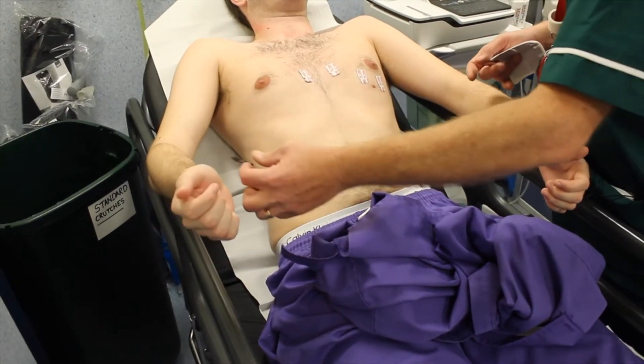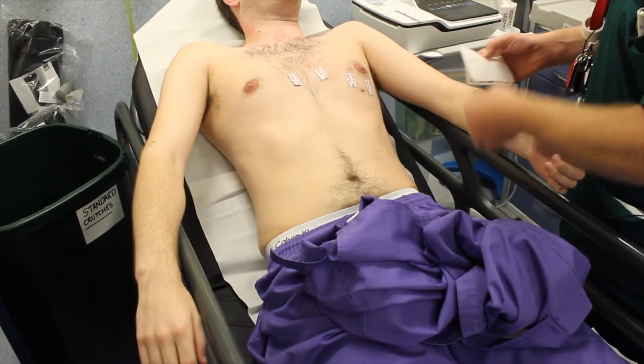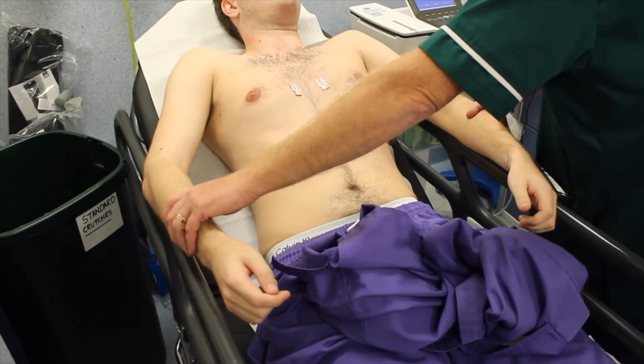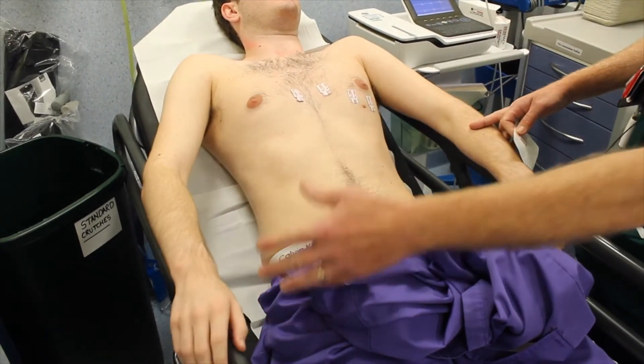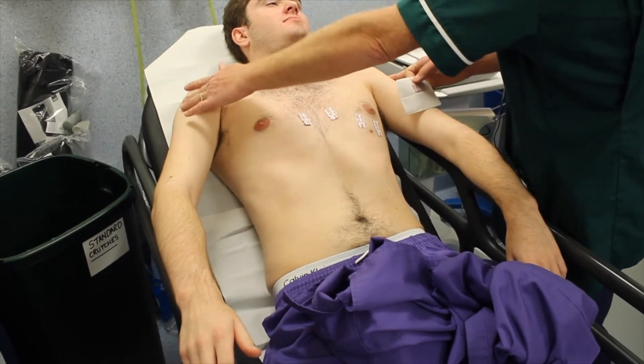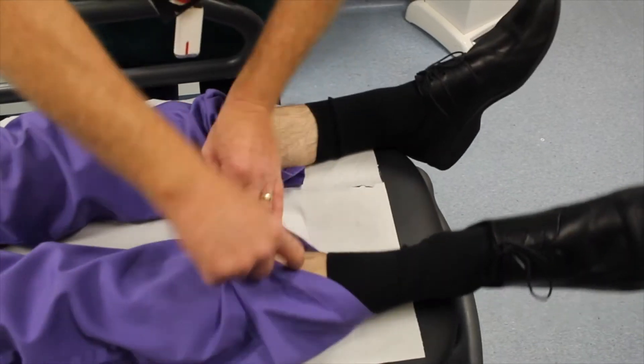Okay Jack, I just need to place two stickers on here — these are your wrist placements. You're nice and warm, you're not cold, you're not going to tremble. If you've got anything like Parkinson's, what I'd do is place small here to minimize the artifacts. I'm just going to place two on your lower limbs.